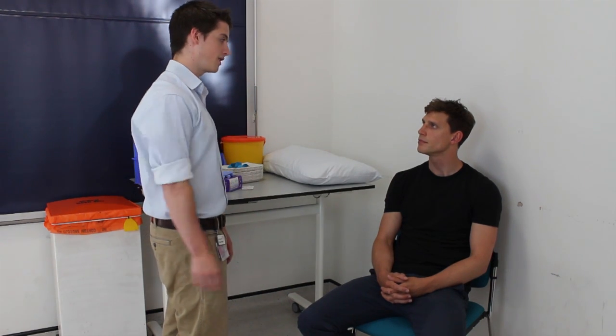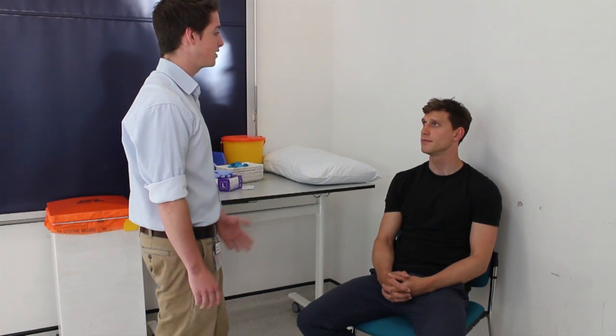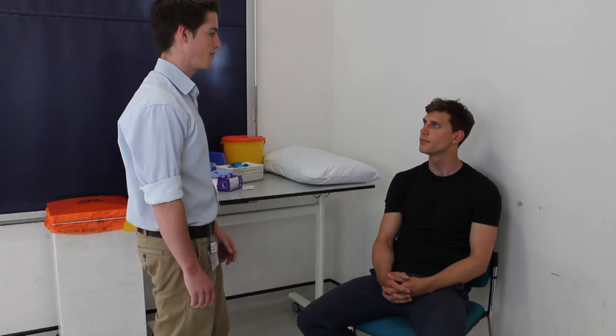Do you mind if I talk to my colleagues as we go? Please do. Thank you very much. So I'm just going to start off — I've checked the patient's happy with the procedure, but I'm just going to confirm their identity as well. So would I just be able to ask your full name please sir? It's Tomswell. And could I just check your date of birth as well? 26th of the 1st, 1989. And are you allergic to any medications at all that you know about? No. Okay, thank you very much.